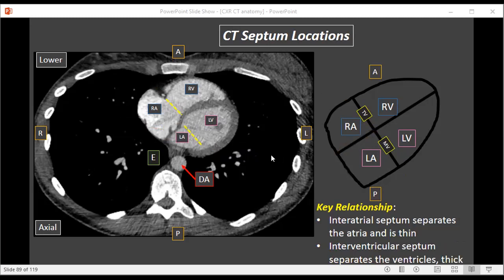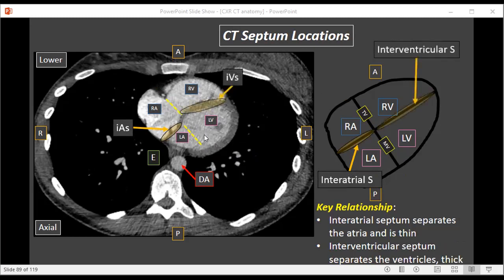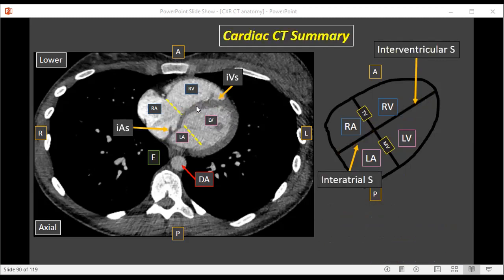The septa can be hard to see on CT, but if outlined you should be able to identify them. The interatrial septum separates the right atrium from the left atrium. The interventricular septum separates the right ventricle from the left ventricle — it's actually a portion of the left ventricle wall but we term it the interventricular septum because it separates the two ventricles. Cardiac CT summary: four chambers — anteriorly, right atrium (most right-lateral) and right ventricle (most anterior); posteriorly, left atrium (most posterior) and left ventricle (largest chamber). Interatrial septum separates the two atria; interventricular septum separates the two ventricles. Tricuspid valve separates right atrium from right ventricle; mitral valve separates left atrium from left ventricle. All of this occurs in the lower chest, where the only major vessel we also see is the descending thoracic aorta.